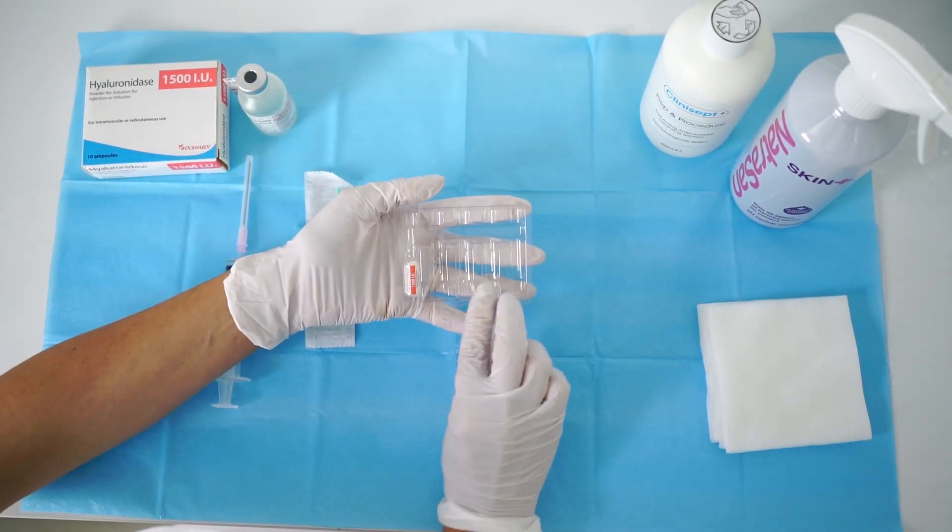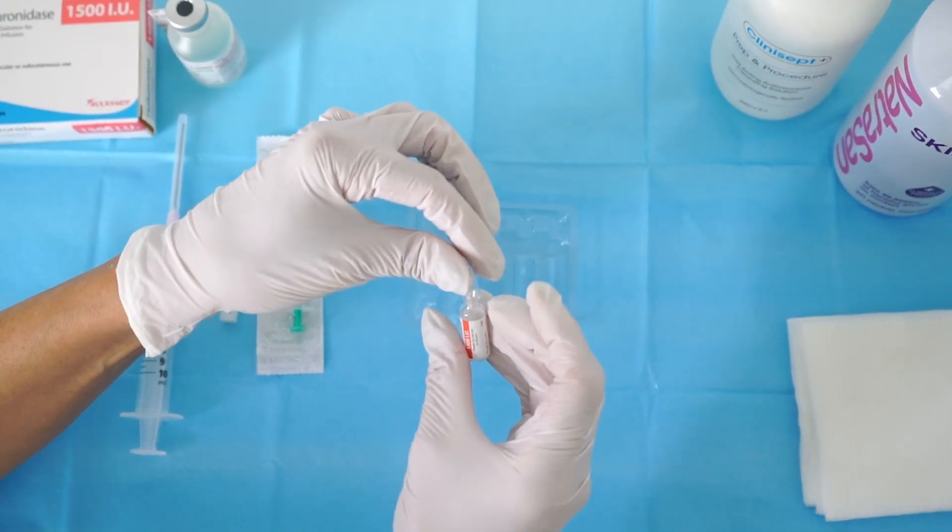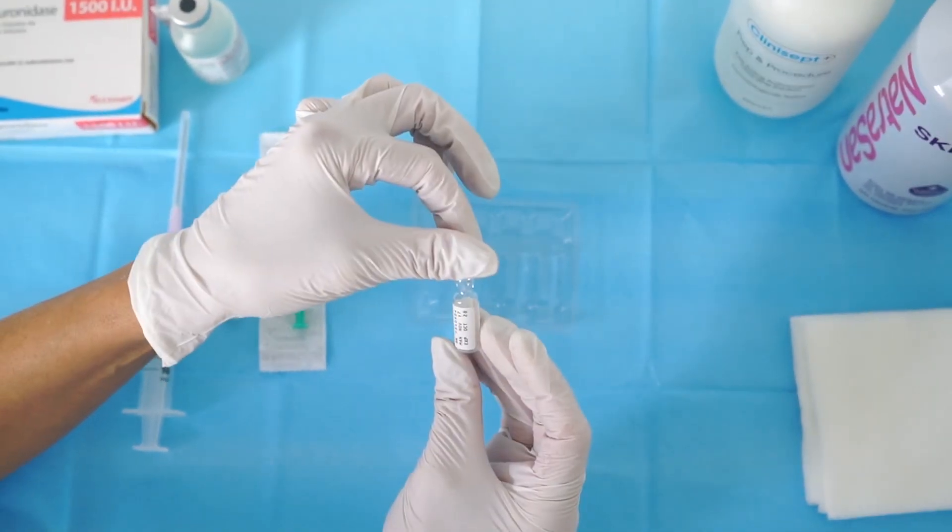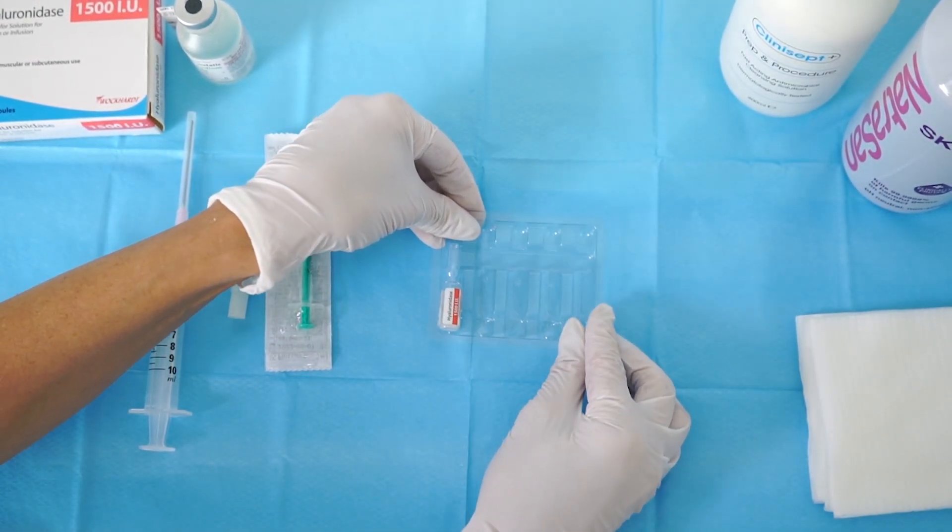The vials come like this, it will be 5 vials usually, 10 vials in a pack. And you can see it's a glass small vial with your expiry date and everything as you would require it to put under medical records.